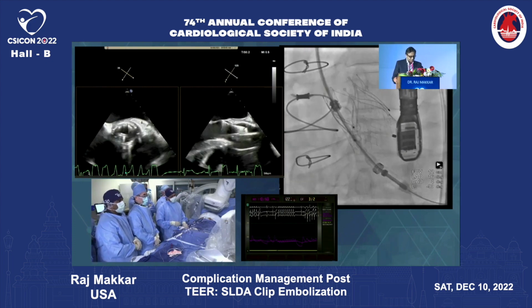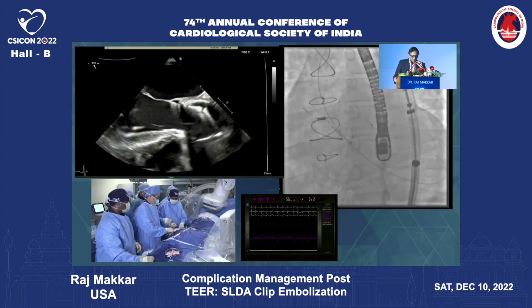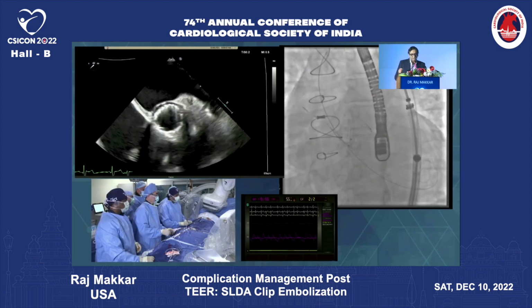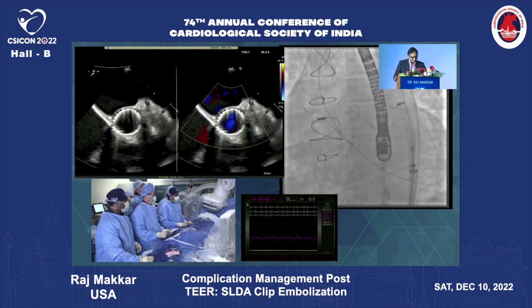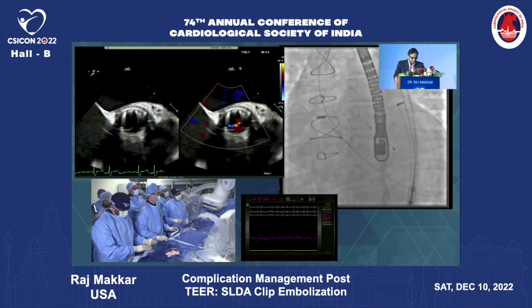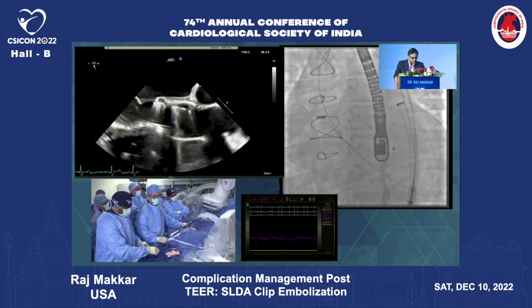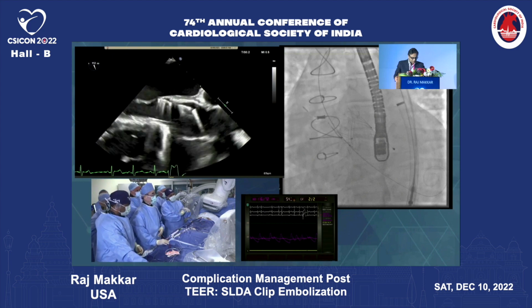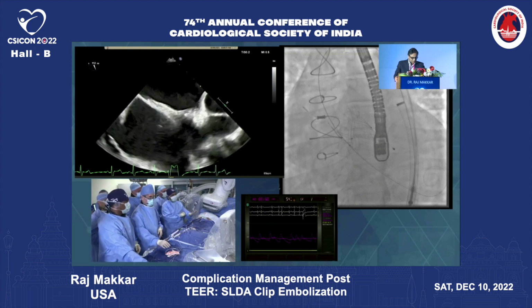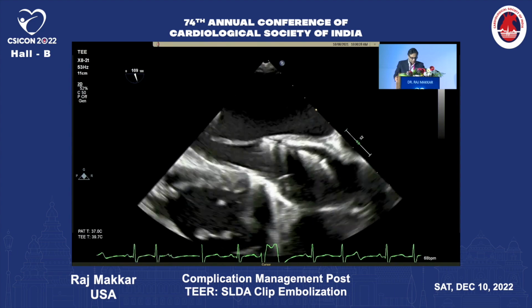All right. So Saba, can you show us our valve? The valve looks like it landed really well on echo. There is no paravalvular leak. Okay. All right. So yeah, take your time, Saba. Tell us what you see. And I think it'll be great for us to see the physiology that you showed to us before the procedure, to see the pre and the post.